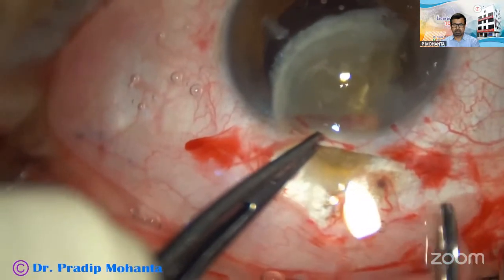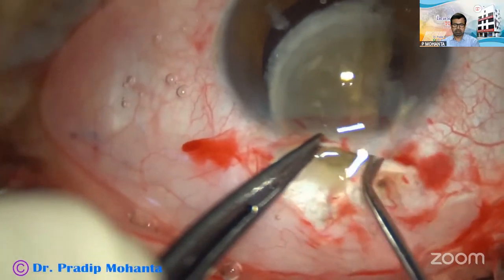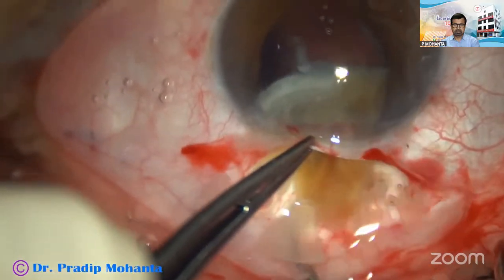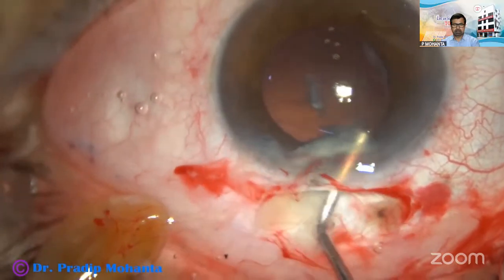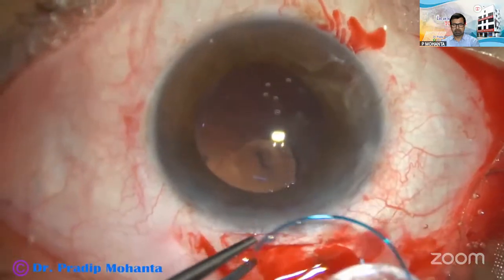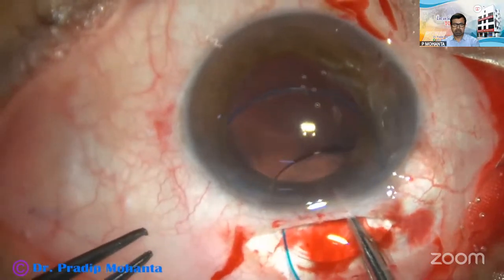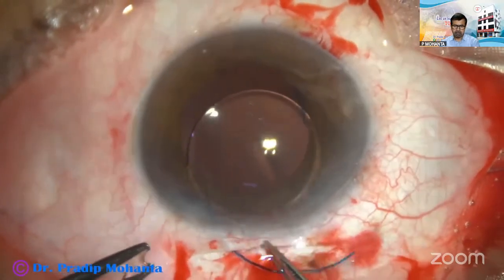Visco on either side, both right side and left side of the piece. Press the posterior wall and the piece comes out. So visco expression was done for this heminucleus. A multipiece lens is placed in the sulcus.